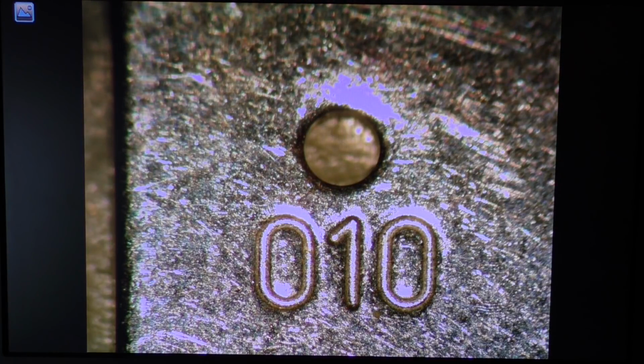Let me see if we can see that. Yes, looks like the moment before. How can I get back? Oh, that's the next picture. Okay. And that's the video. How can I start that? Okay, now it runs backwards. Okay, now it's playing back. Yes. I'm not moving anything, that's just a playback. And it plays back exactly what was recorded, so that is working.